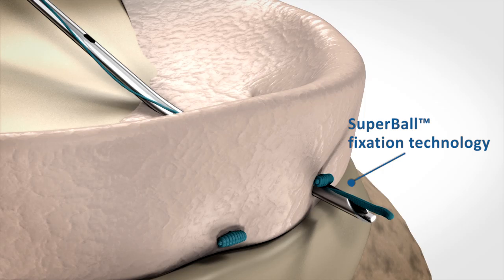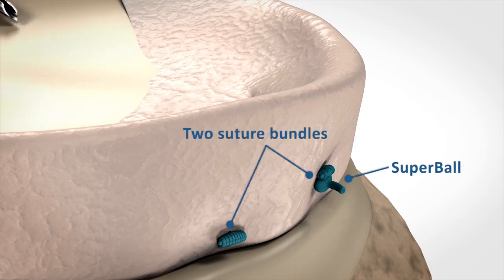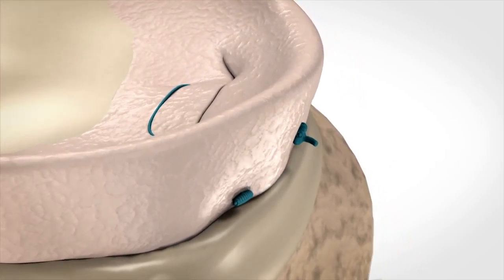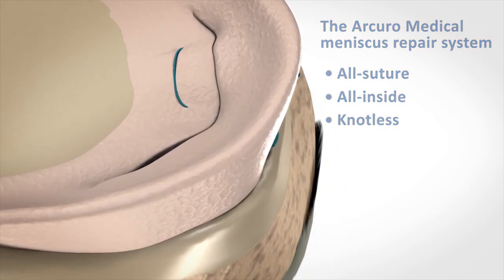To secure and lock the entire fixation, the Arcuro system uses its novel Super Ball technology. As the needle is withdrawn, the two suture bundles and the Super Ball remain in place at the peripheral side of the meniscus. Arcuro's novel All-Suture All-Inside Knotless System eliminates long-term damage to the knee.